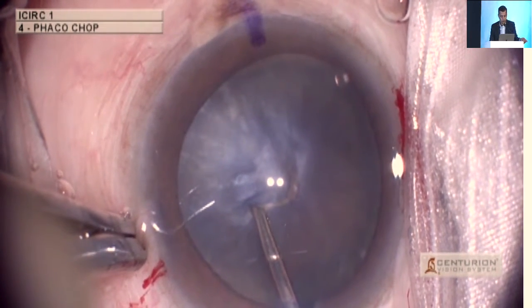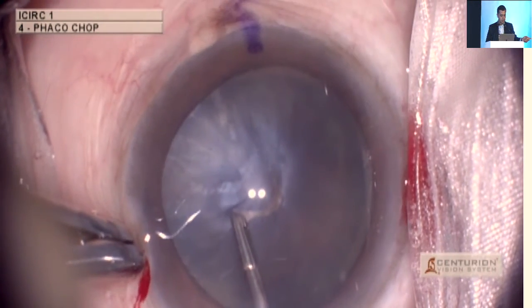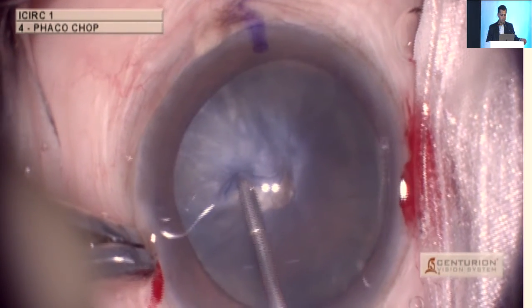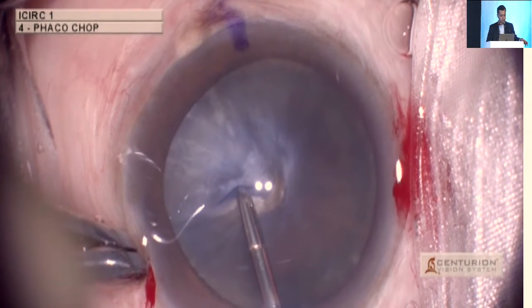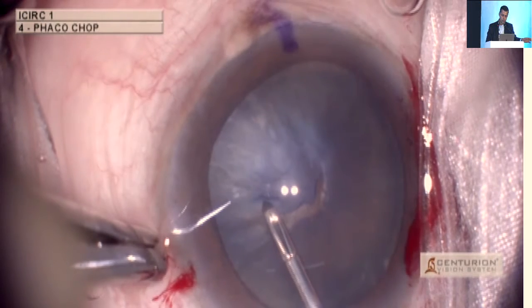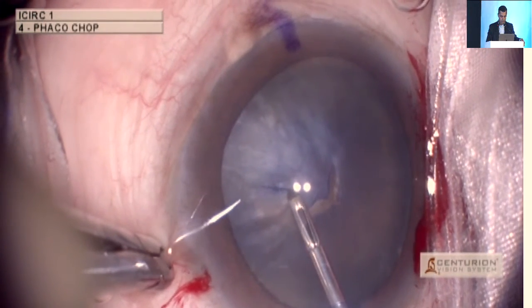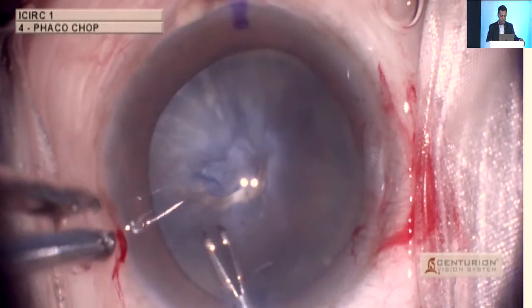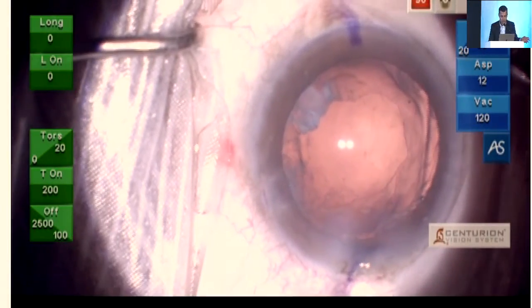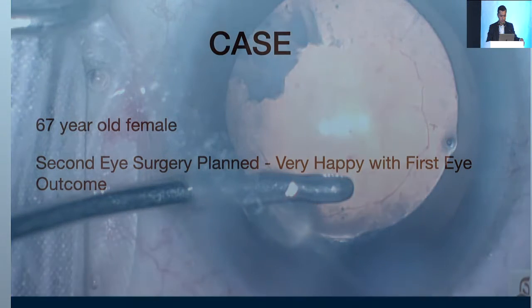Should I just continue? Should I get microrhexis scissors and try to cut it off? So I'm just hoping that the thing peels off. But if I give a little more traction, this thing is going to run peripheral. So I think wisdom over the years has taught that it's best to let it be, and start a rhexis from a totally independent place when a situation like this arises. So I'll just see, it's not moving. So I will, at this point in time, start a rhexis from some other direction. I'll just move ahead in the interest of time. And finally, I was able to pull a rhexis from this side and convert it into a rhexis, and that's the end of the surgery.